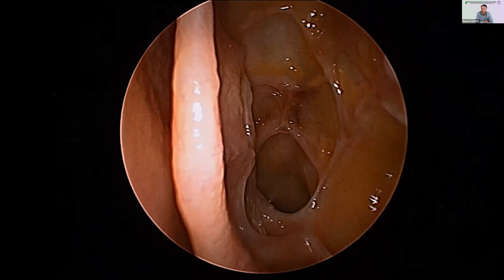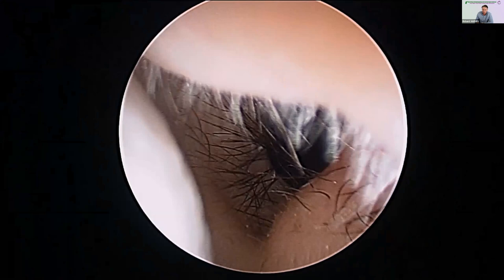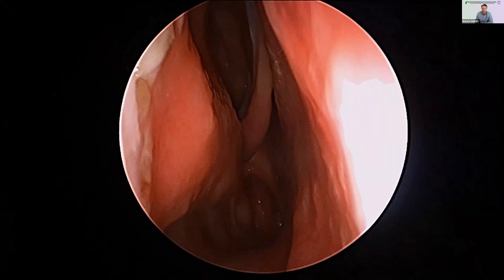What you're looking at now is almost like a really nice giant middle meatus — as if someone had really favorable anatomy to do your sinus surgery. This is important because this look is excellent: you can just look straight up, and it's like a giant middle meatus with a huge, big opening up into the frontal. A very nice opening and a very easy zero-degree view.